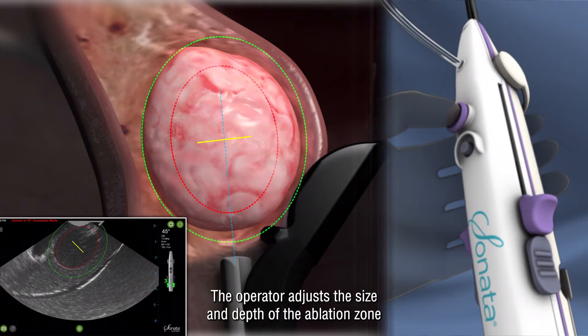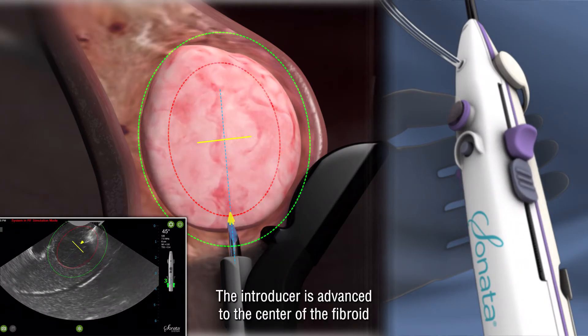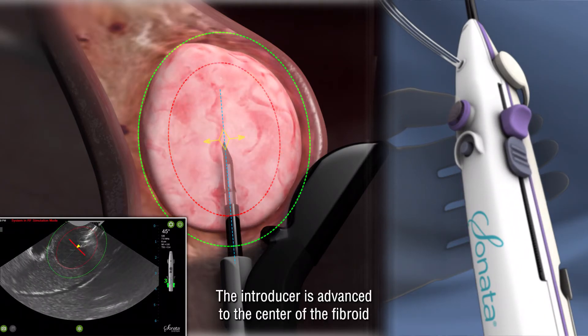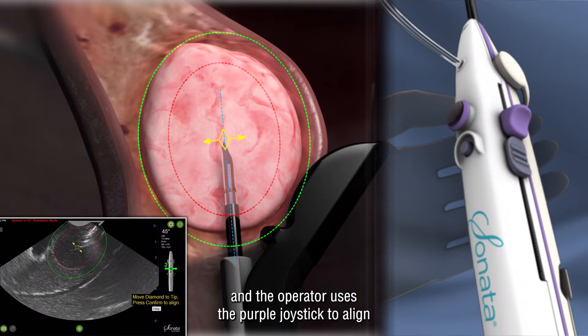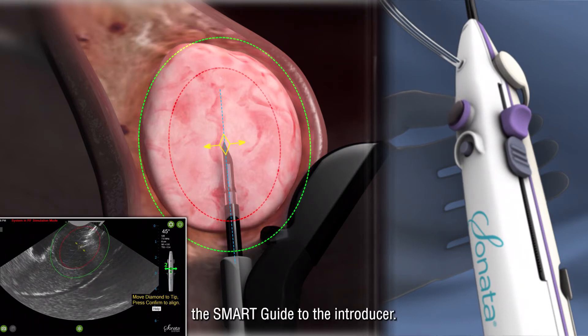The operator adjusts the size and depth of the ablation zone using the purple joystick on the handpiece. The introducer is advanced to the center of the fibroid, and the operator uses the purple joystick to align the smart guide to the introducer.